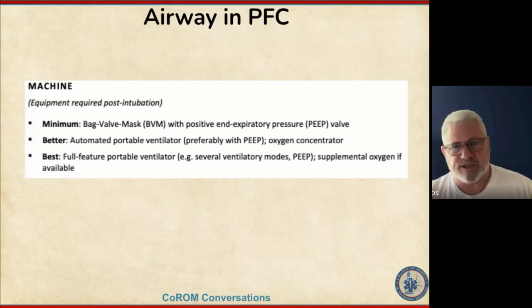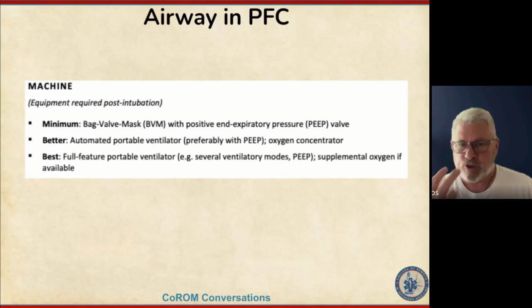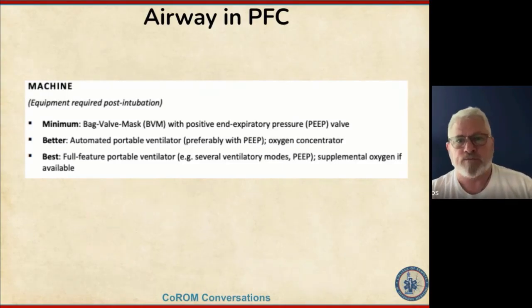Now, depending on how your hearing is in the environment, you may not be able to hear that. But if your patient is conscious or awake, or you're in this training, you'll actually feel, as the patient, where the leaks are. And then you can just use your fingers and point where the leaks are occurring. And then when you realize your hands are too small or the gloves are too slippery and you're not able to maintain a seal in a completely benign classroom environment, then what are the odds that you're able to maintain a seal, one person with one hand, in a stressful, real-patient-in-front-of-you environment?